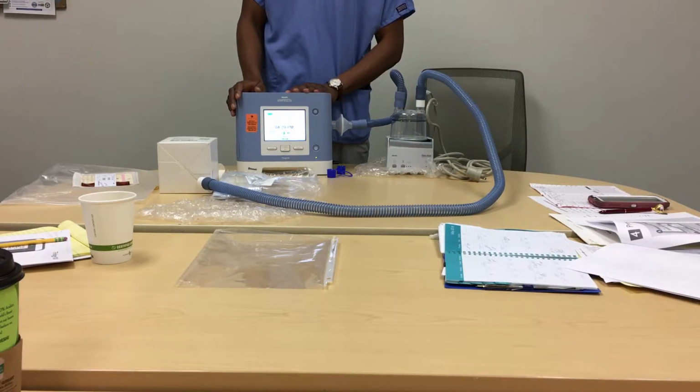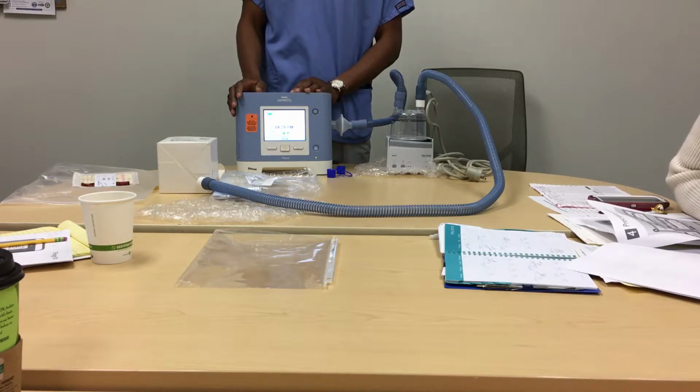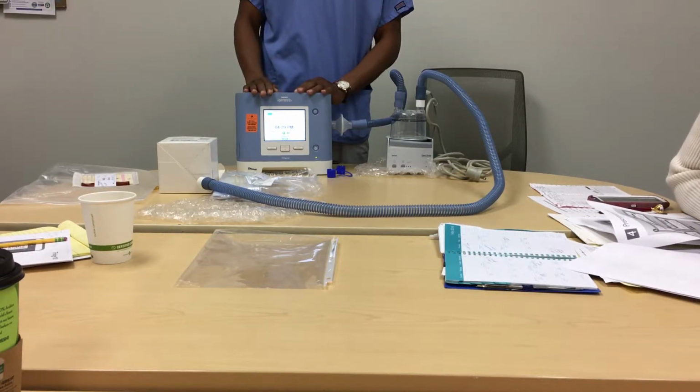patients get really sick, especially invasive ventilation patients, because they didn't take care of their supplies. So to me, it's always a good thing to go out there and check, especially upon initial setup. You have to make sure they are comfortable and can use it. Any questions?